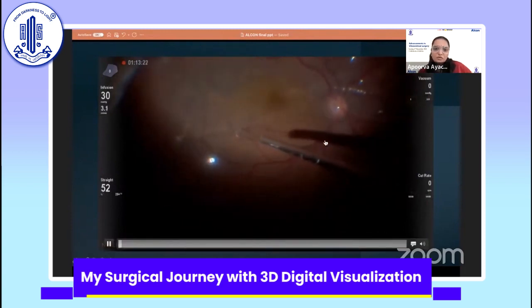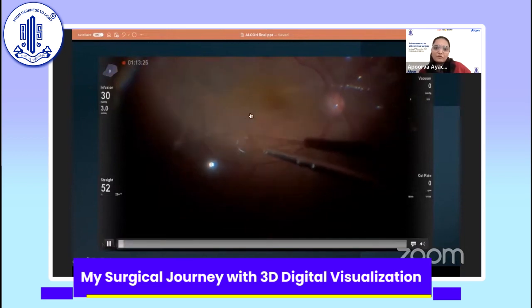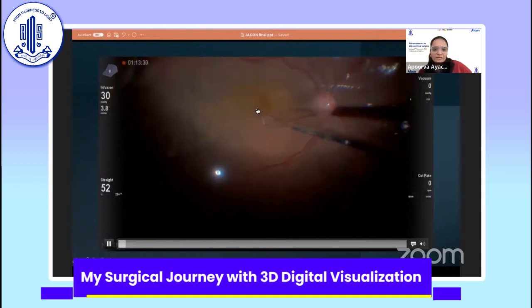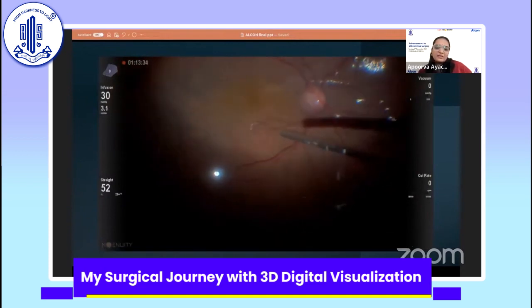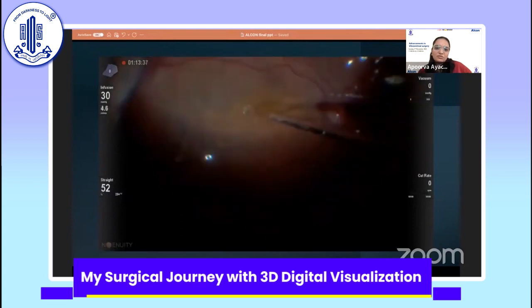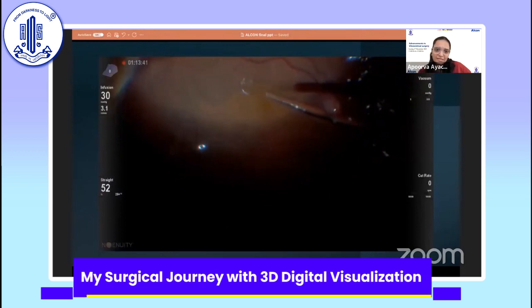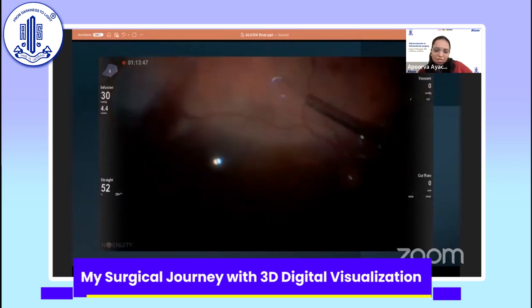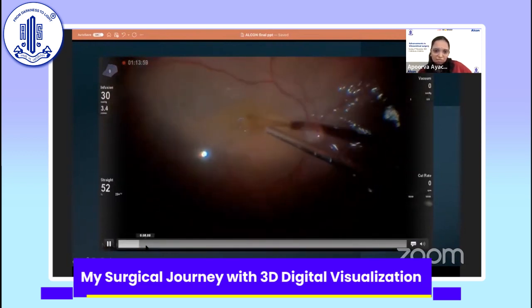This was a case of an RD with some subretinal gliosis in the periphery and this kind of macular fold also. And there was some ILM wrinkling here, and since we need very little excuse for peeling the ILM, although I do feel that it was necessary in this case. Anyway, so I started trying an ILM peel, but it was not happening. I used the flexi loop. I was not getting any plane.